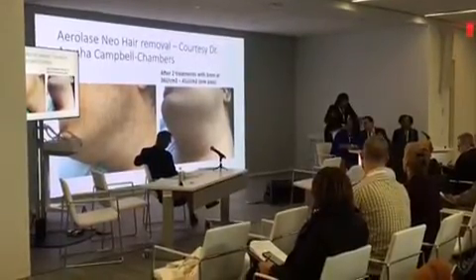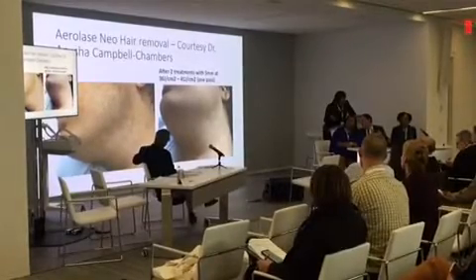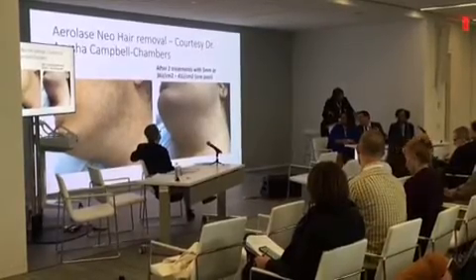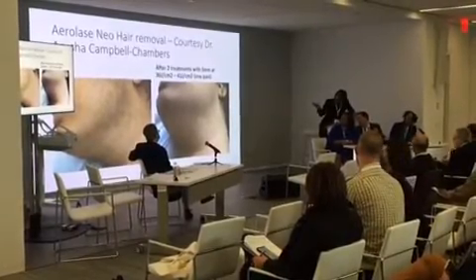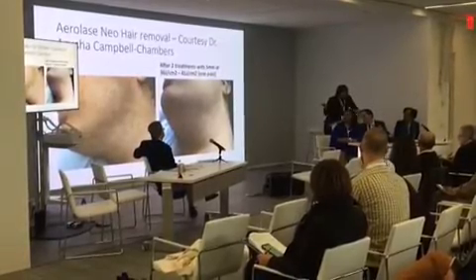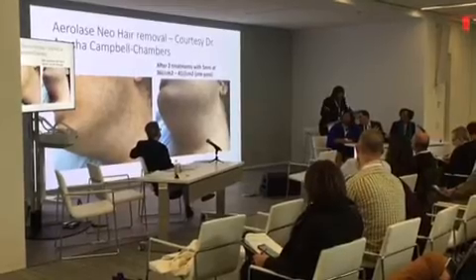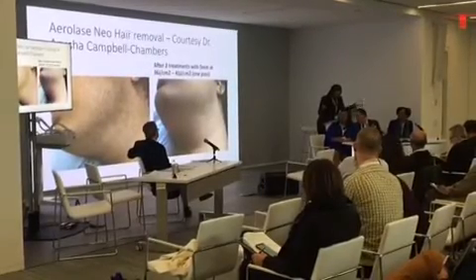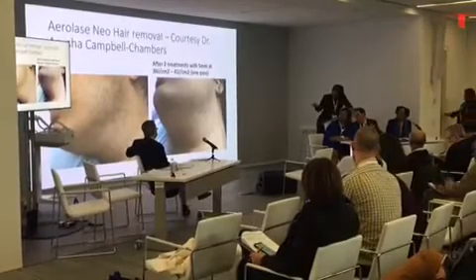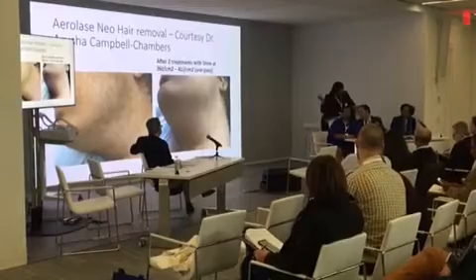I oftentimes test my female patients and refer them to be treated if needed for underlying factors, and manage expectations. So we have patients that may come back. She comes to us, she has PCOS as well. She comes every 3 months or so for her maintenance, and that's fine with her. It's great compared to the other hair removal methods. And again, I was able to use the 5mm lens in this patient.